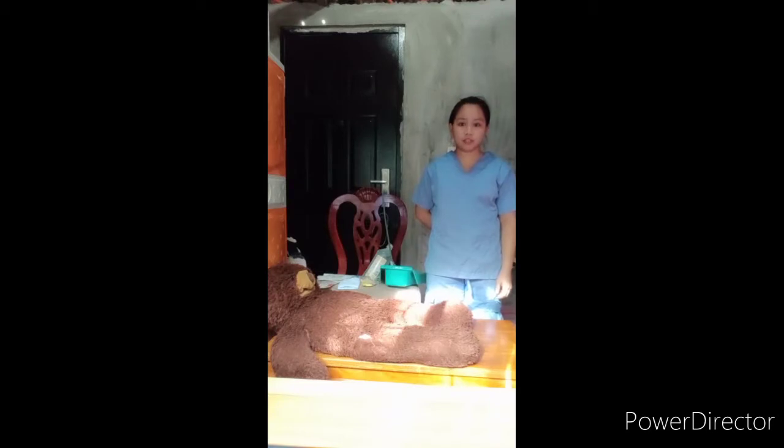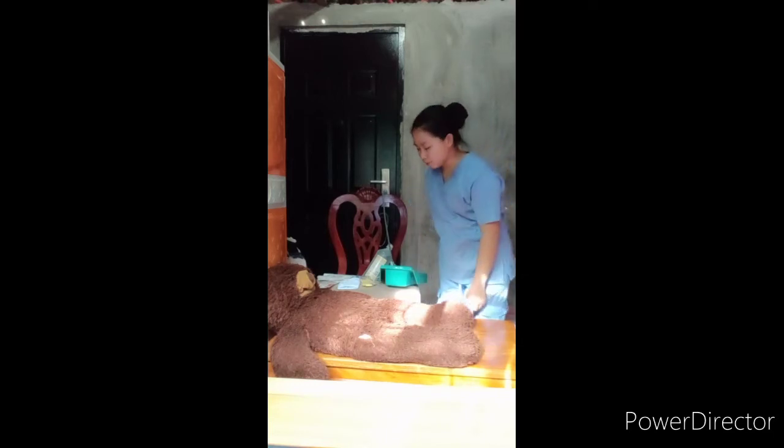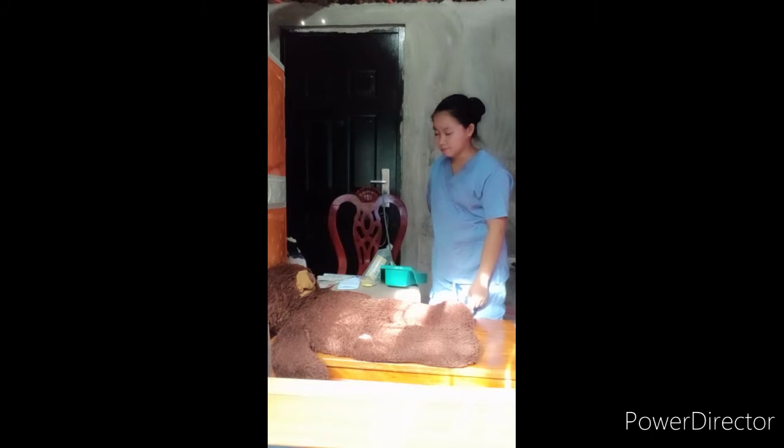Performing airway suctioning. Before the procedure, let's provide client privacy first by closing the door or drawing the curtains. Next, let's identify the patient's identity using two identifiers. Good morning, ma'am. I am Giselle Esteban, your student nurse for today. May I know your name, ma'am? Can you state your name and your birthday?